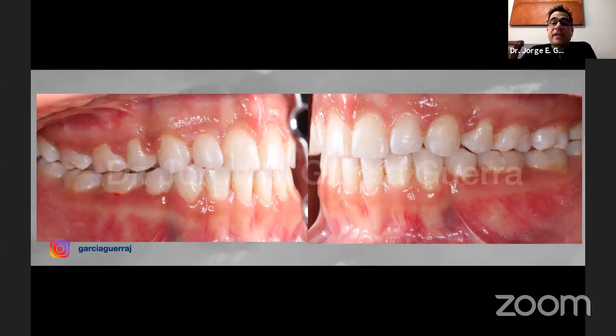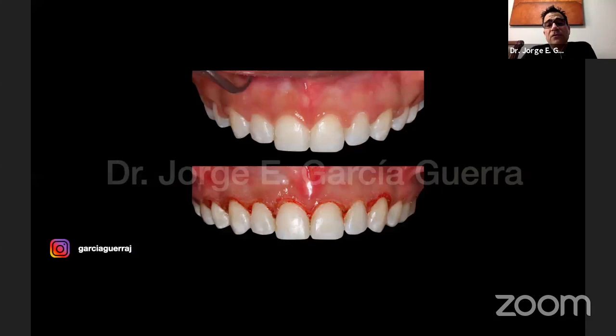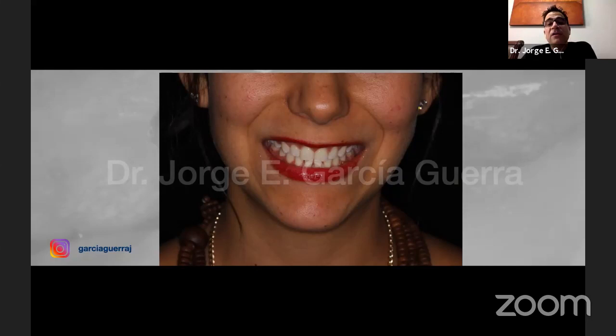So in this case, this was a patient that I finished about two or three years ago. So we did some gingivectomy. We still didn't do it with the laser, but it's like this is with an electrical instrument. We removed the excessive tissue that we had there, so we have a better result at the end. Now you can see at the end that she doesn't have a gummy smile. She has a better inclination of the incisors. And this is a very common situation that we can use in our office to correct that overbite.